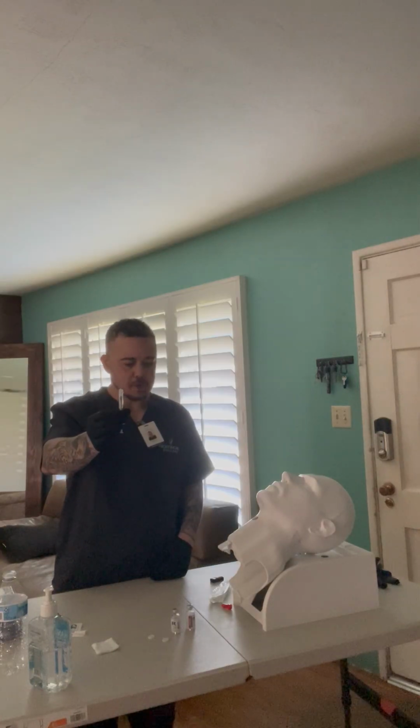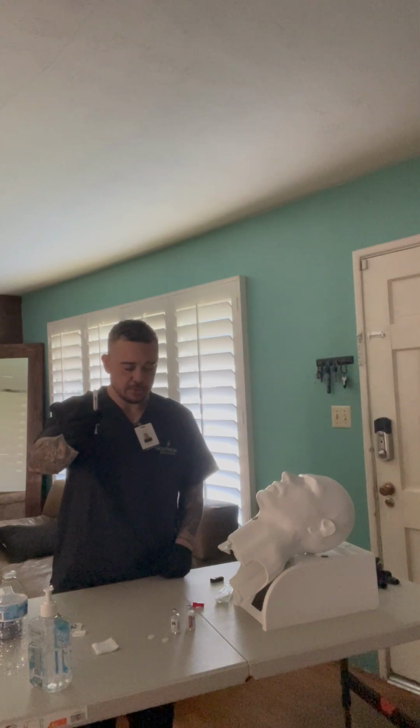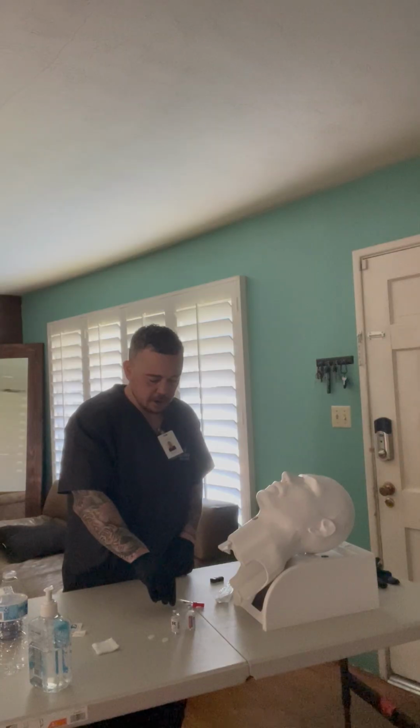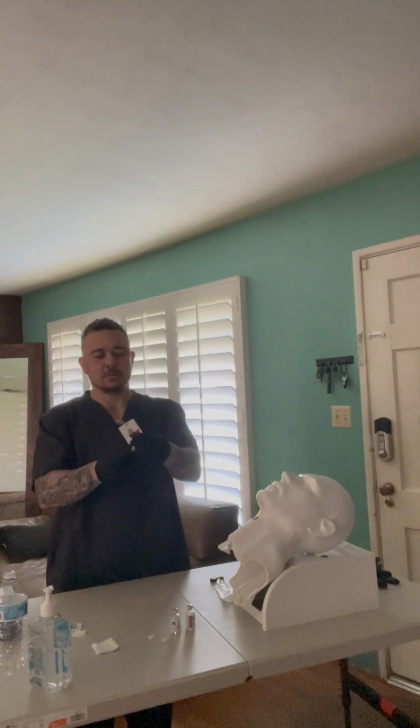Now that I was able to do that, I'm going to recap my needle by putting the needle into the cap here without touching it. Just like that.